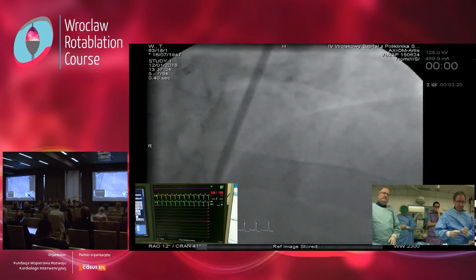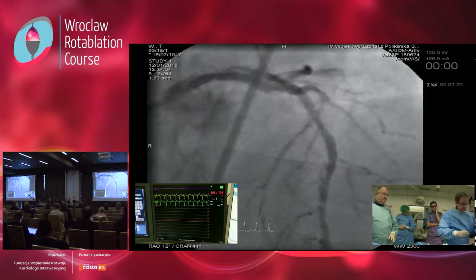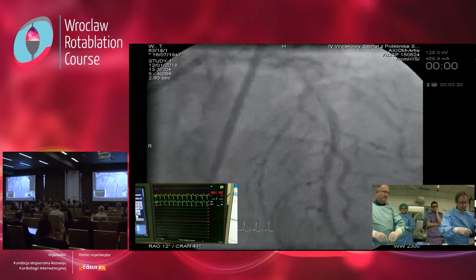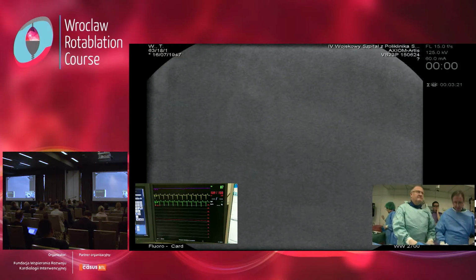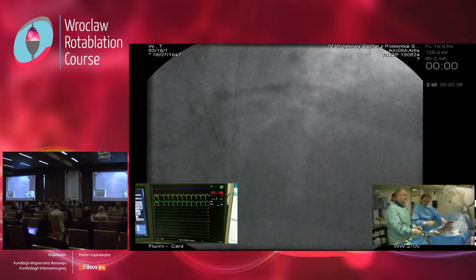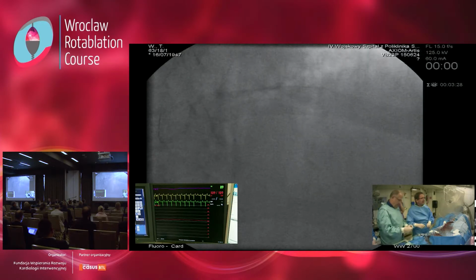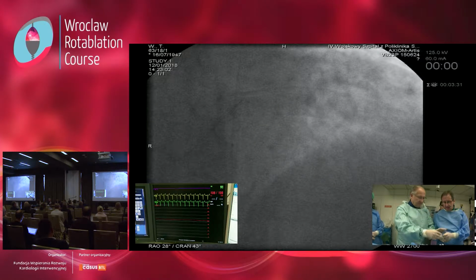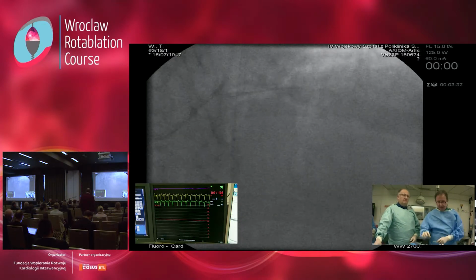But in the other projection, this mid-LAD stenosis looked quite tight. So I would be concerned that it is perhaps too big a burr in this situation. I think it's still okay. So I would just go now with 1.5. We go now live, so we didn't cross the lesion. What I have is Fine Cross, and we go now with Samurai wire, which I like and use in daily routine in our cath lab in Bad Krozingen.